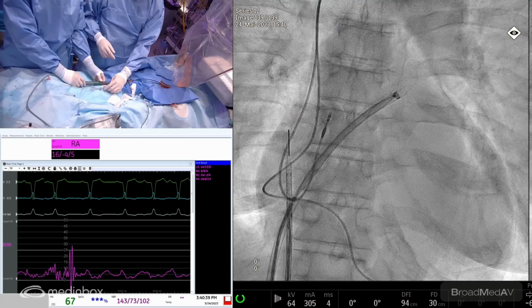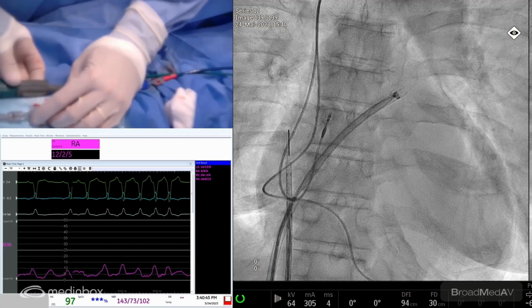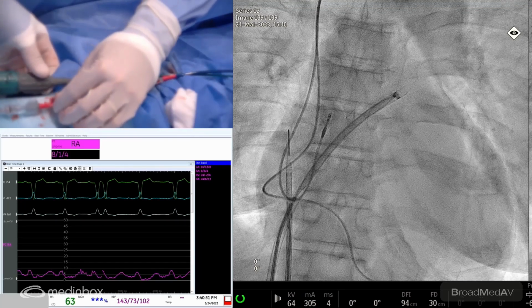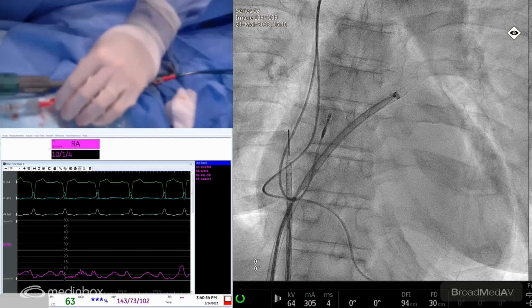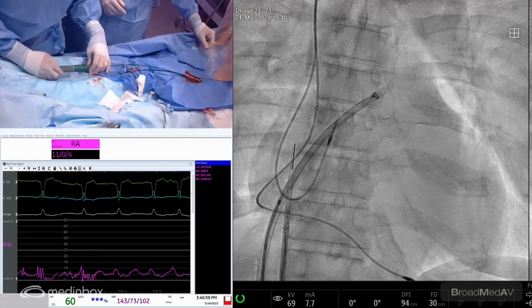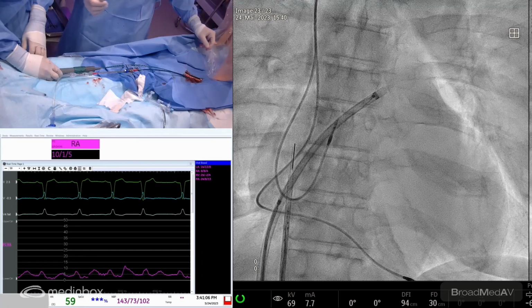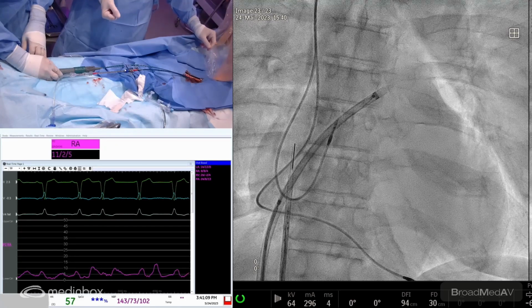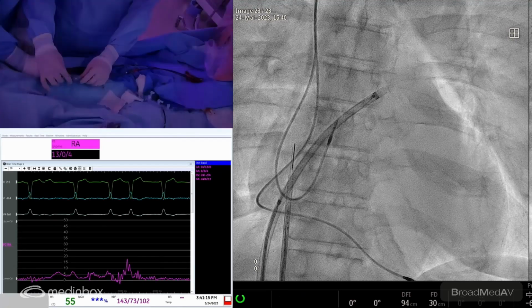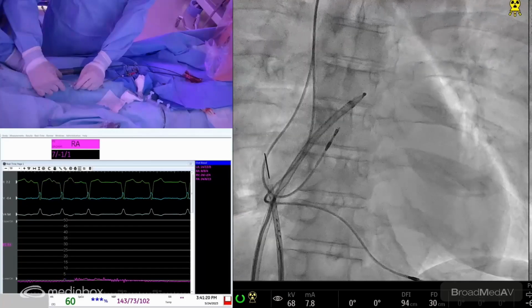Maybe we can show it with a nice image, maybe. I'm going to wait for you. Best that I can offer. I think I lost my image. Just a quick fluoro. Yeah, over there. There you go. See, this is, I think, the best that we can offer on echo. It's sure going to be easier once we deploy the first part of the device and we come to the septum, we're going to have a nice image over there. Okay. Yeah. And achieve the left side. I think we should see well the left disc on fluoro, but also on echo.